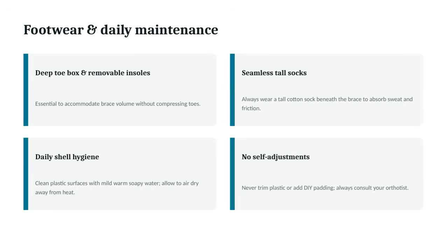For daily shell hygiene, clean the plastic surfaces with mild, warm soapy water and let them air dry away from any heat source to maintain the material's integrity. Lastly, avoid any self-adjustments. Never trim the plastic or add padding on your own. If adjustments are needed, always consult your orthotist to ensure safety and effectiveness.